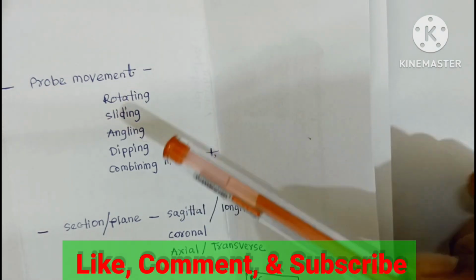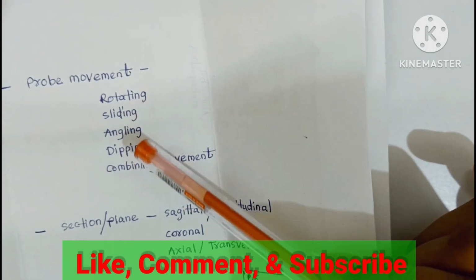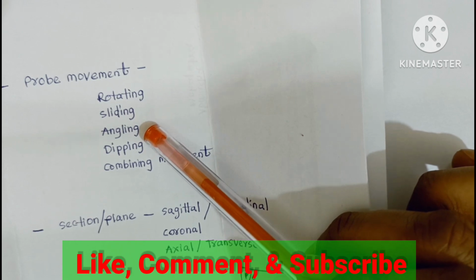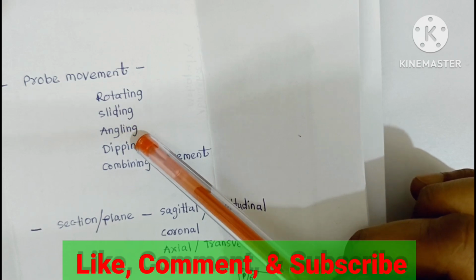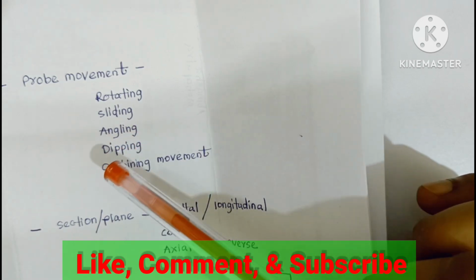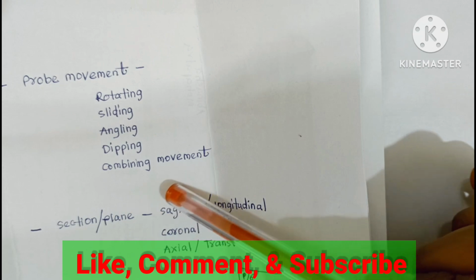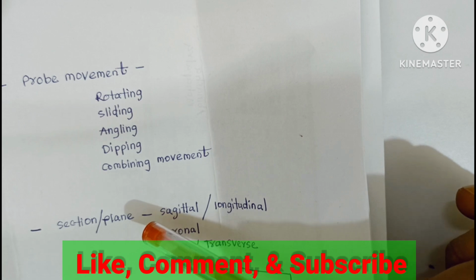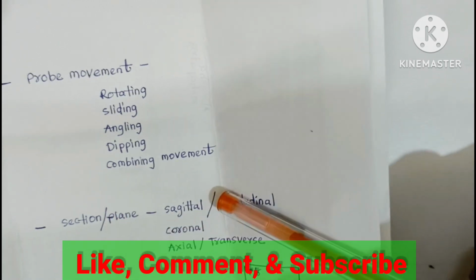What is the meaning of dipping? Another movement is angling and dipping. Dipping is along the narrow axis, angling is along the broad axis. Dipping is followed by sliding, and angling is also followed by sliding. After dipping, sliding brings the targeted image to a horizontal plane.